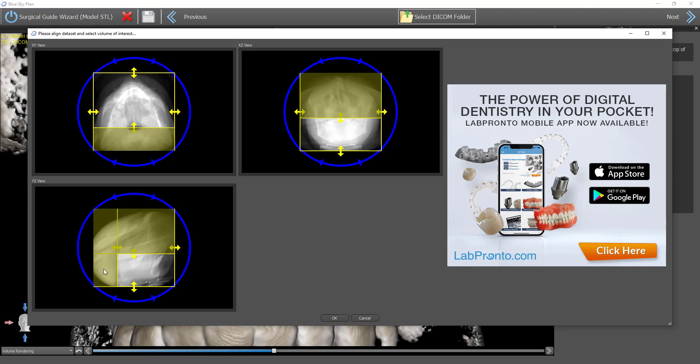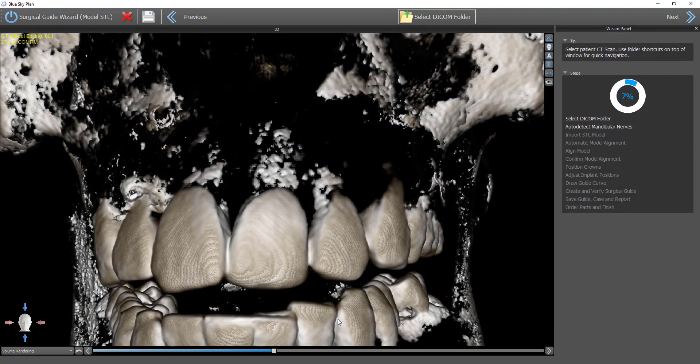What I did on the left is I've grabbed and dragged the borders to select the relevant field of view. Once I have that selected, I'm going to go ahead and click on OK.